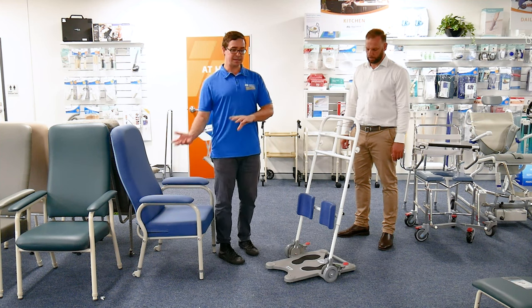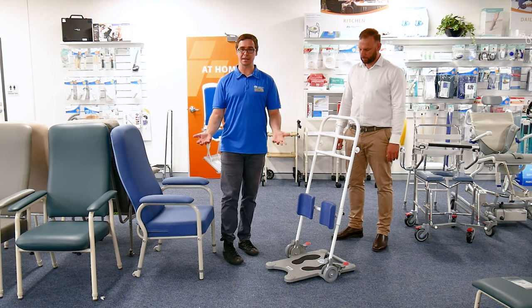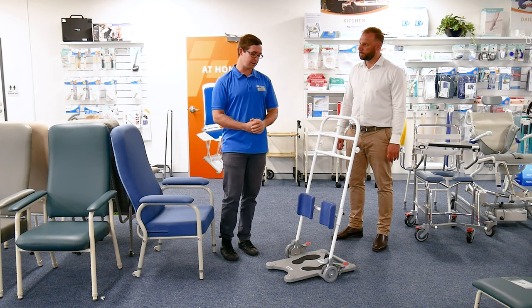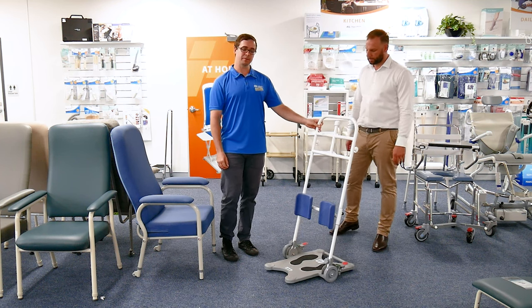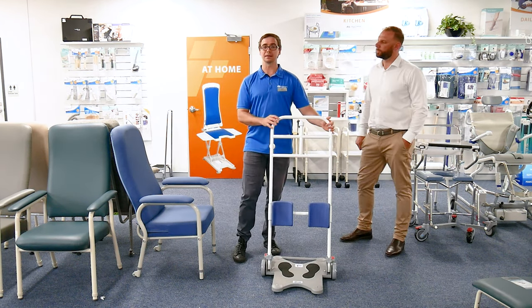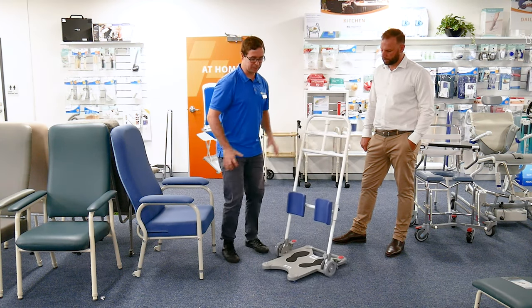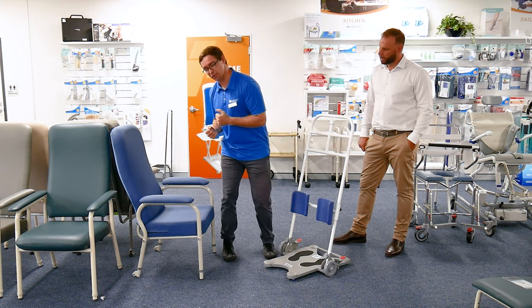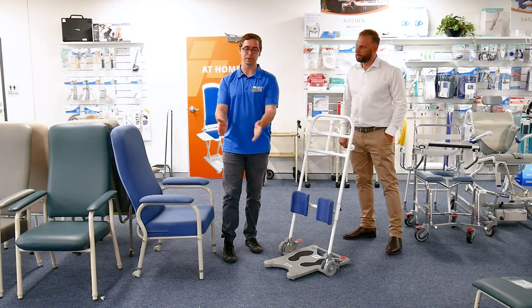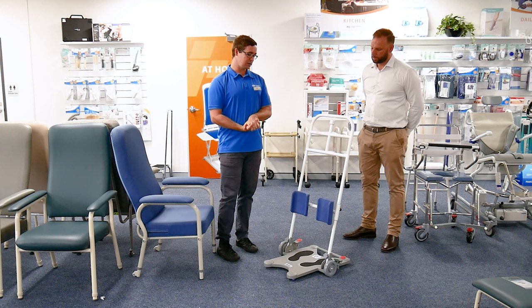Occupational therapists or physiotherapists would be looking at trialing and prescribing this piece of equipment for somebody who is able to pull themselves up from sitting, maintain a standing position while somebody assists them to move around. These types of pieces of equipment became popular to help people negate the manual handling risk of a pivot transfer — helping someone turn around, usually in a 90-degree position from one seated surface to another.